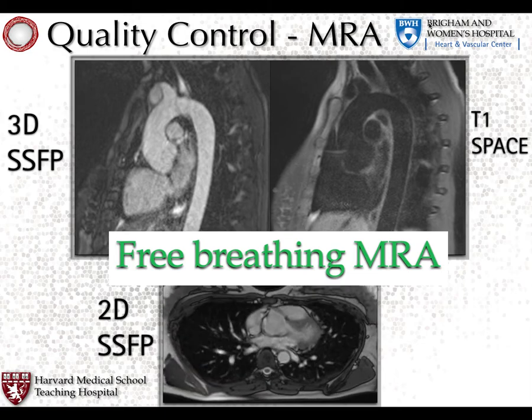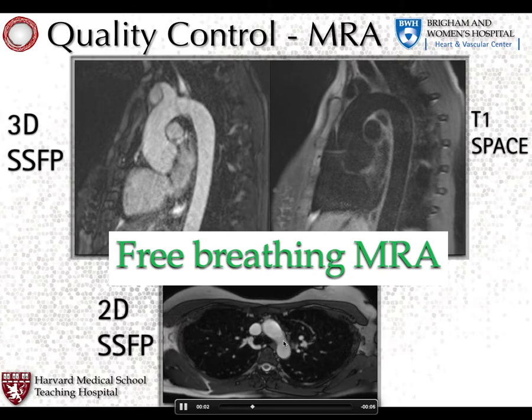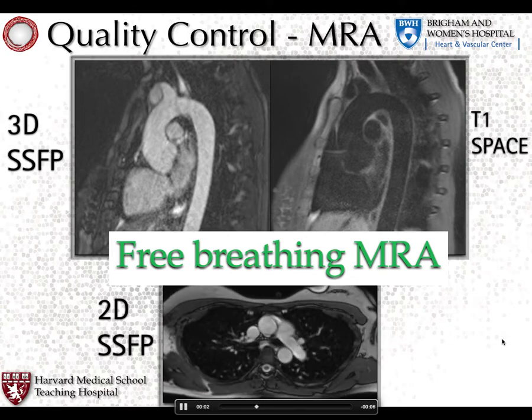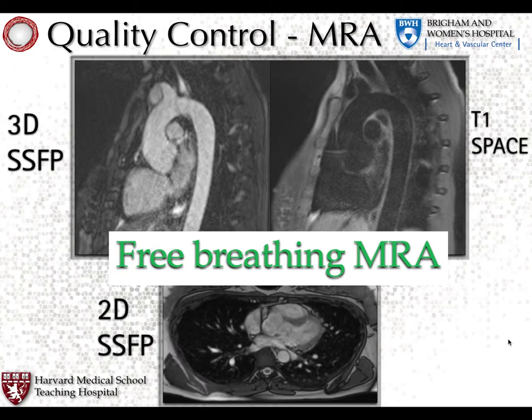So we do apply gating, but you could do pulse gating and get the same results as doing ECG gating if you're just trying to get in diastole, which makes a difference logistically for the techs.